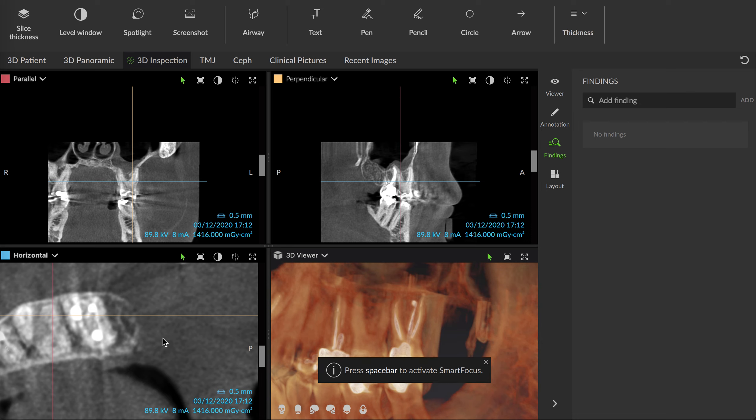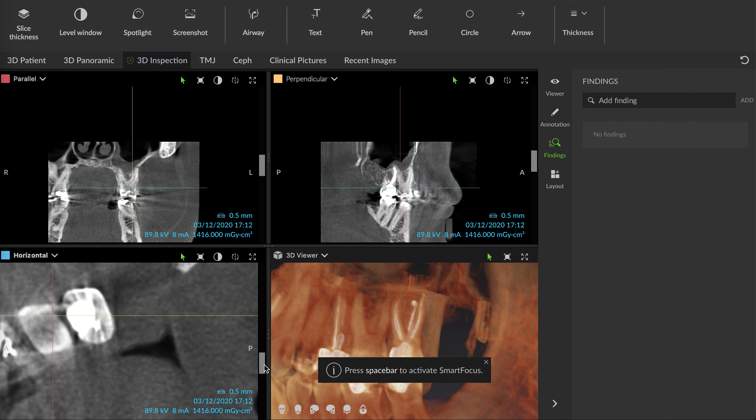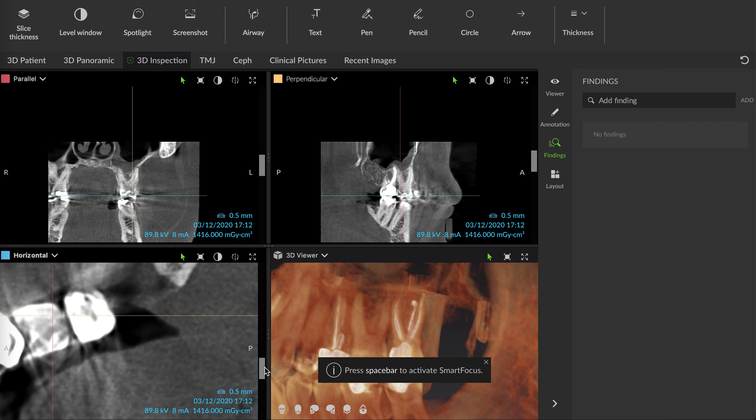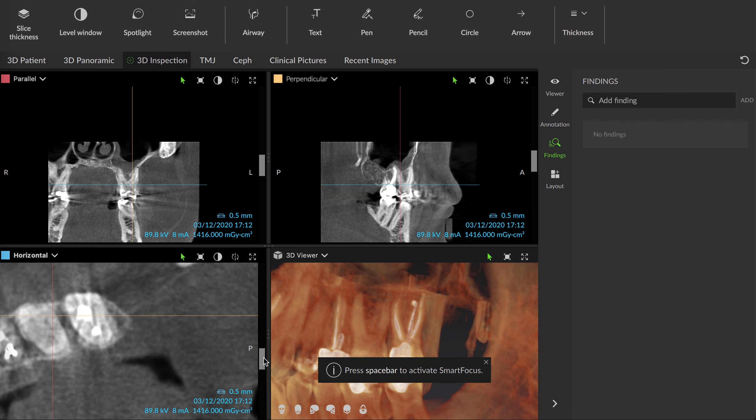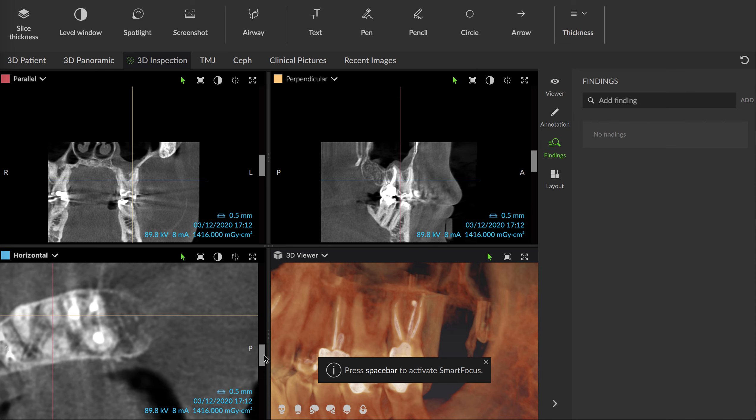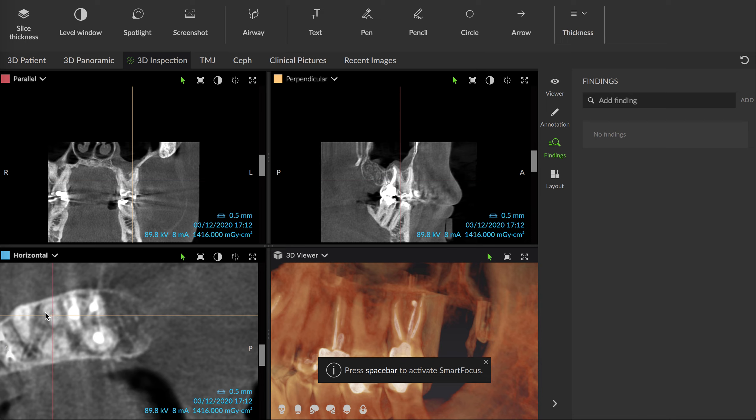Once I was able to scroll through here and determine there was not a mesial buccal 2 canal, after determining there was no MB2 and determining that I was a little too mesial for the distal buccal canal, we got in there. Three canals there, ended up a real nice outcome. The completion was real simple since I knew where the canal was.